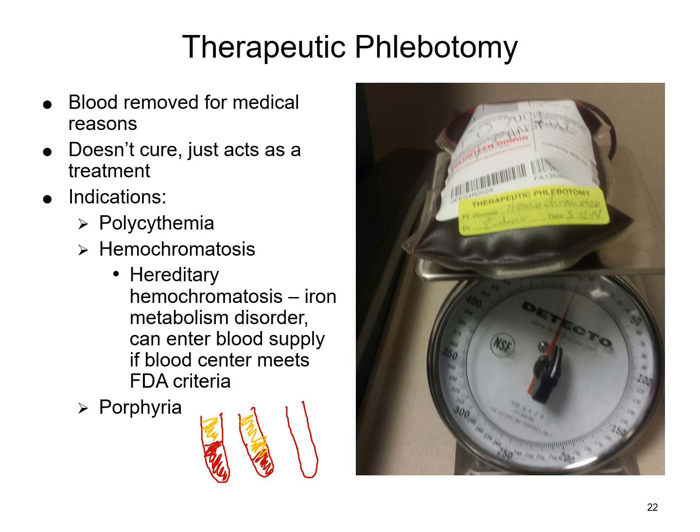If you've got about a 50-50 ratio of red cells to plasma, or a little less on your red cells, then your hemoglobin's about normal. But when you get just a little bit of red cells in a tube when you spin it down, and a whole lot of volume of plasma, that's a very good indicator that the patient's hemoglobin is really low.